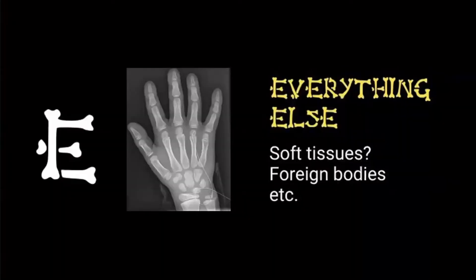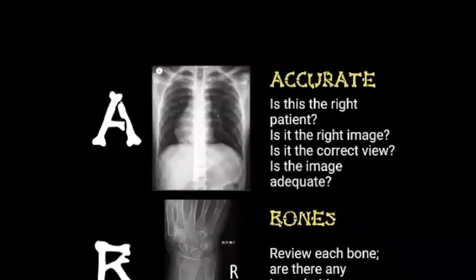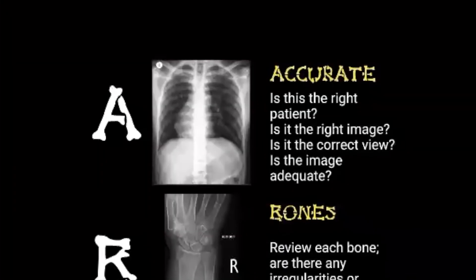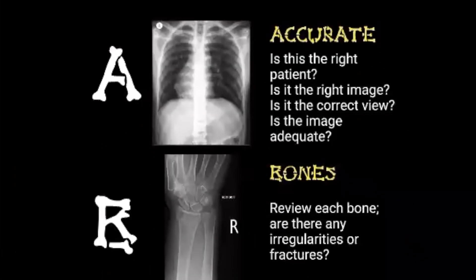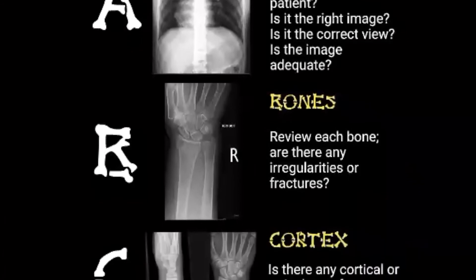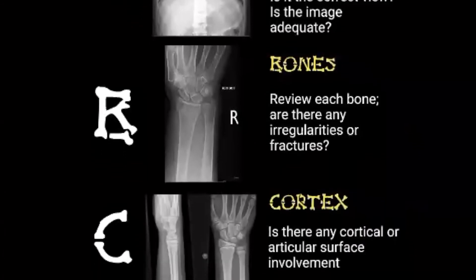E — everything else. Here is a little hand, and you can just see there's a wire running through it. Thinking about soft tissues — are there foreign bodies? Are there fingers missing? Is there something else going on that we're missing? Just thinking about your ABCDs, a familiar principle you can apply to other x-rays.